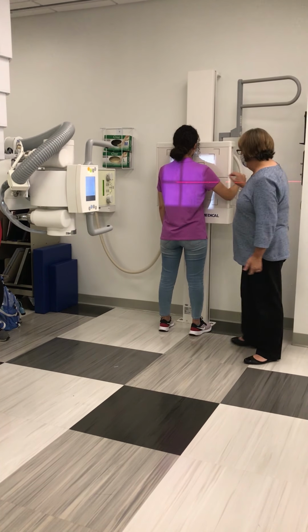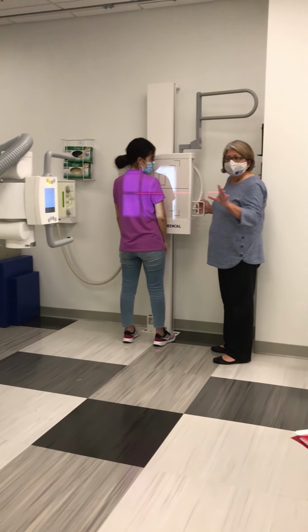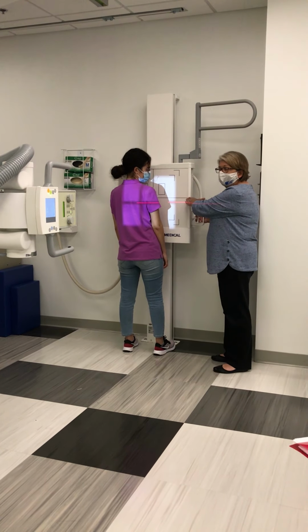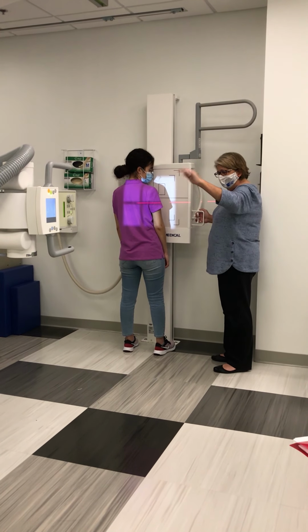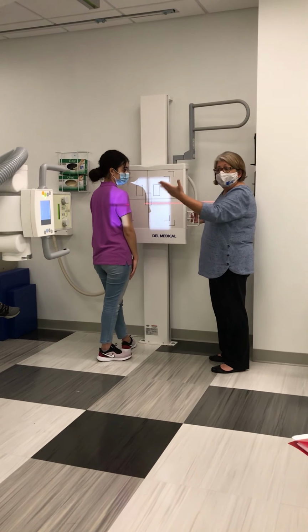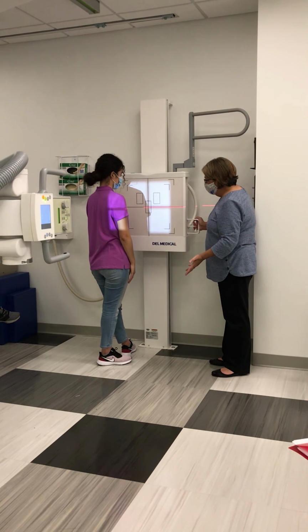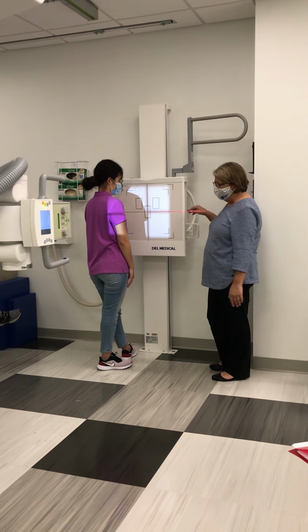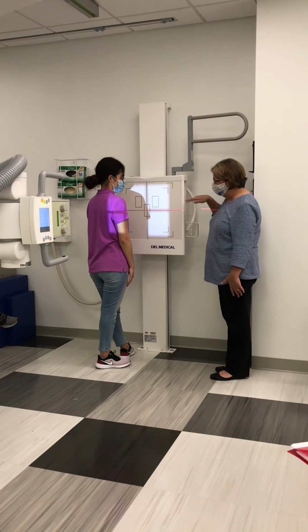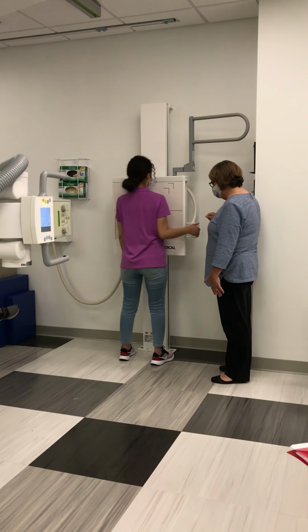Notice how when I do that, now I've got to make sure that I have my central ray and my image receptor aligned. I've got to center my central ray to my image receptor. We know that it is transversely because we put the tube in transverse detent to achieve that. But I have to manually move my bucky to align the central ray with the image receptor in that dimension. Okay, so go ahead and step forward again.